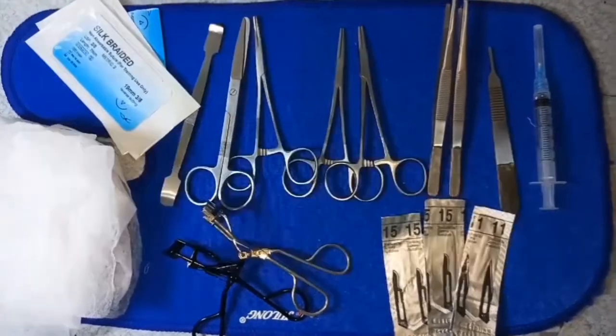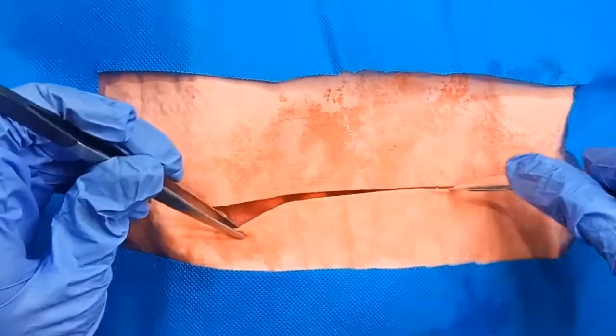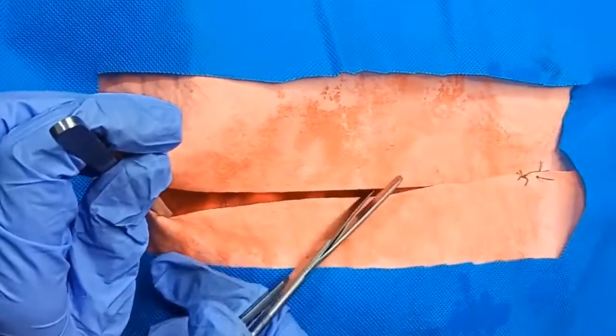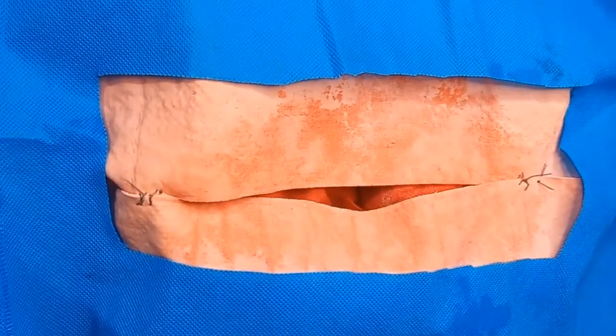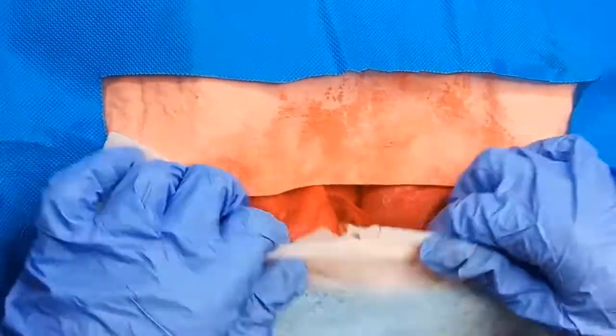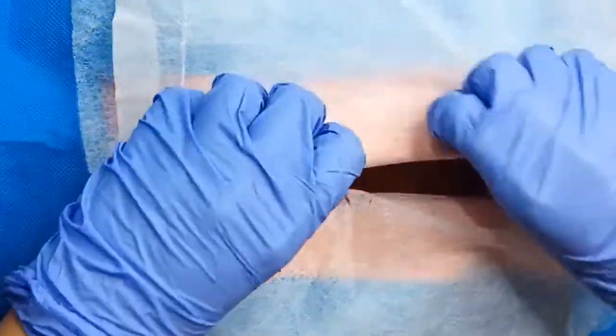The patient must be in dorsal recumbency, and a ventral midline incision is made commencing at the umbilicus. The length of the incision is determined by the estimated size of the uterus. The mammary glands are often hypertrophied, and the surgeon should not invade the mammary tissue when making the skin incision. The wound edges are protected with laparotomy pads moistened with sterile saline.